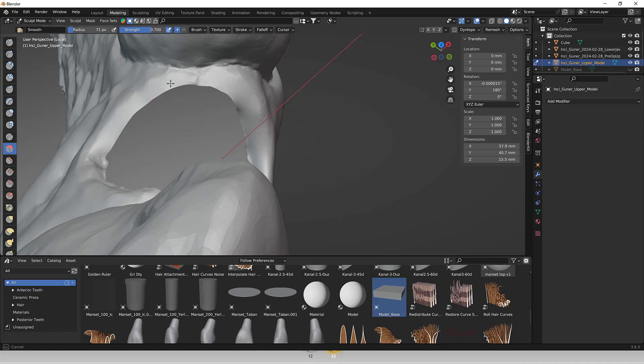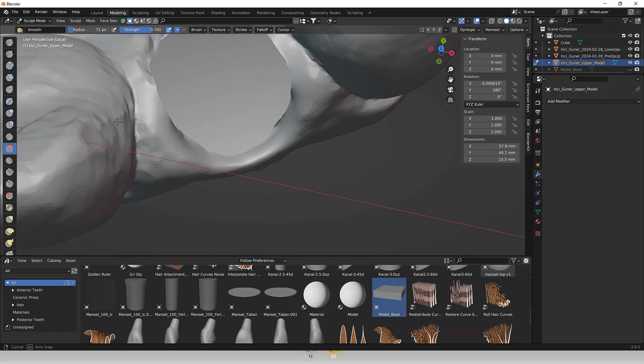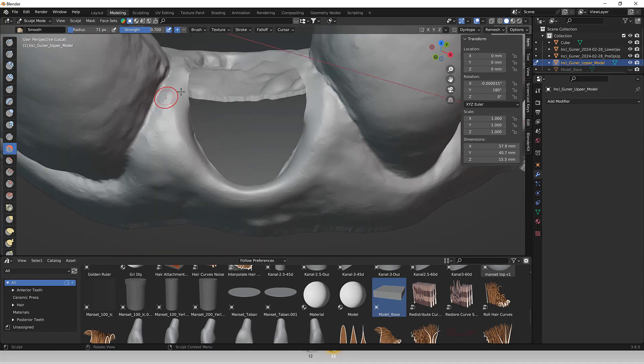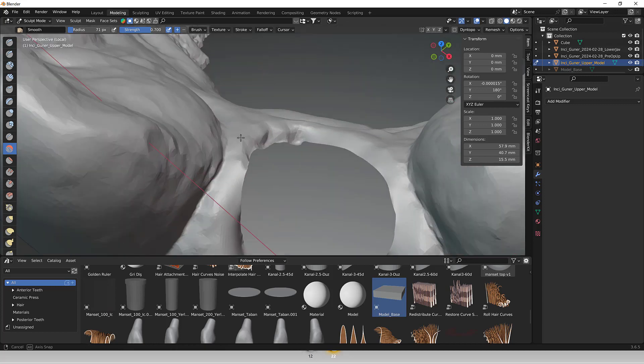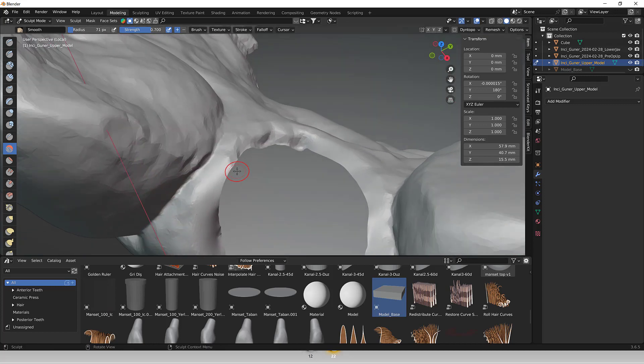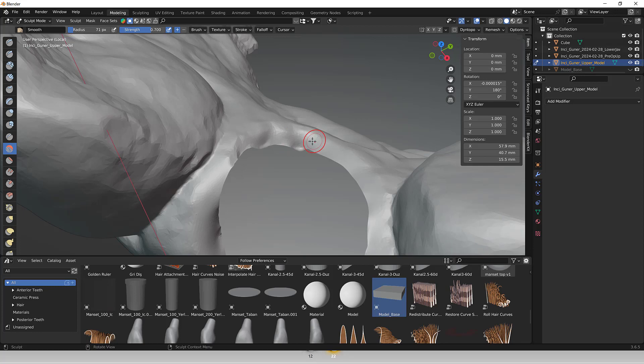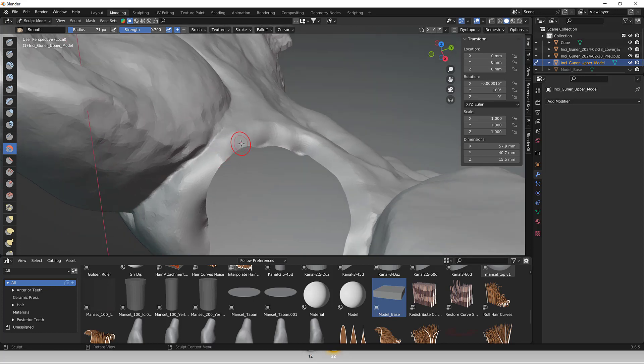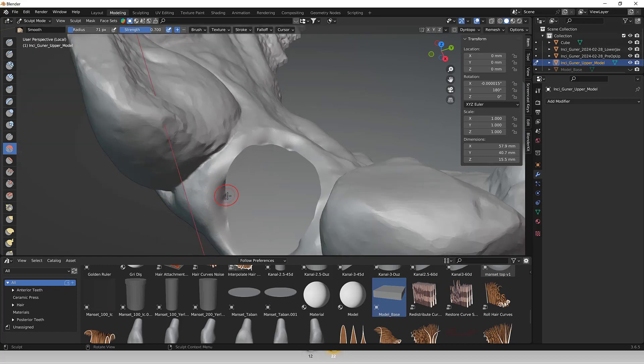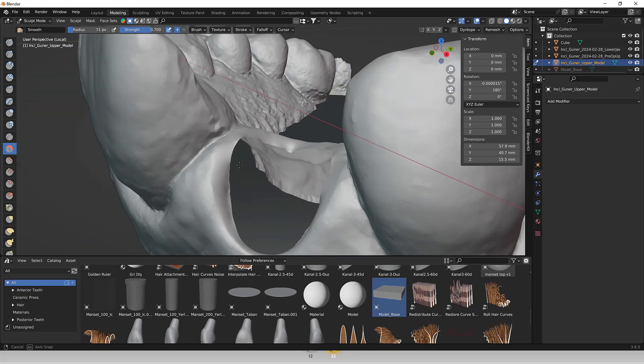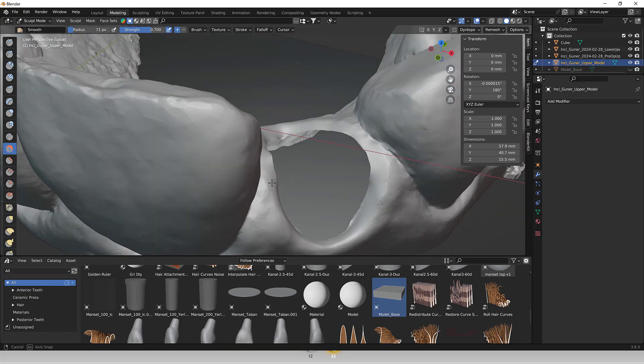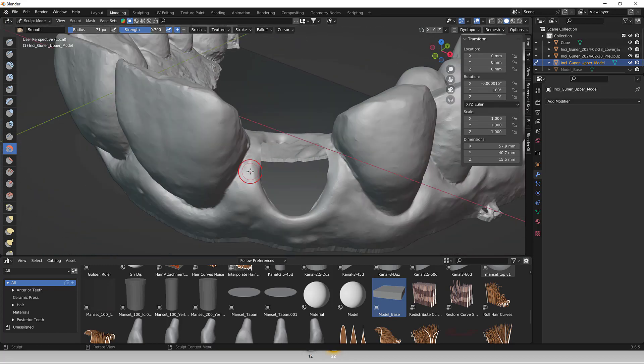Also, texture painting in Blender enables users to add color, texture, and fine details directly onto the 3D models. This functionality is beneficial for simulating realistic dental materials such as enamel or gum tissue and enhancing visual quality of dental models.